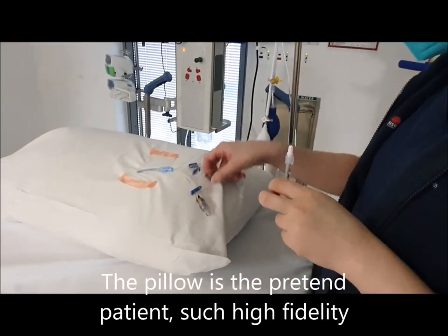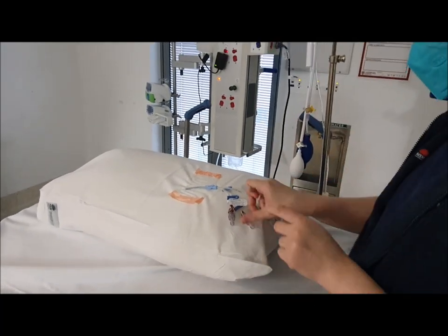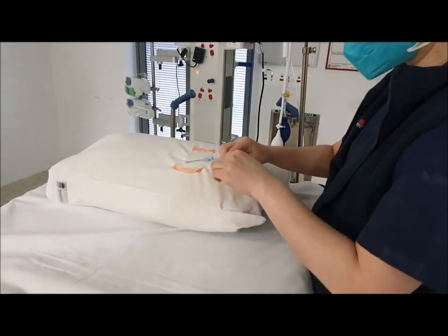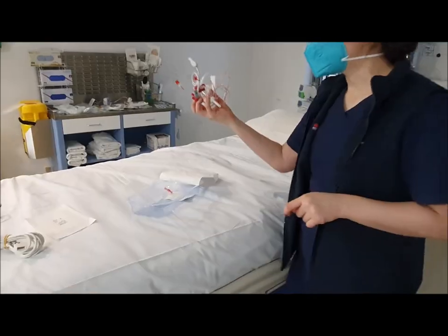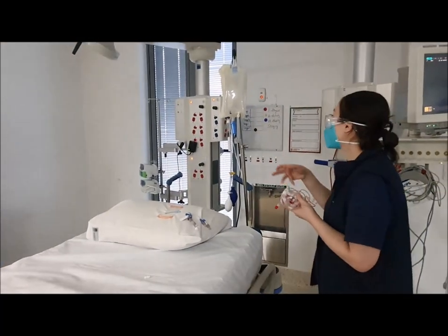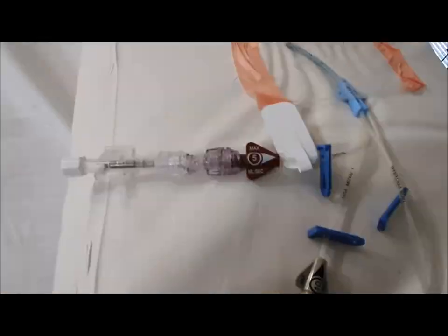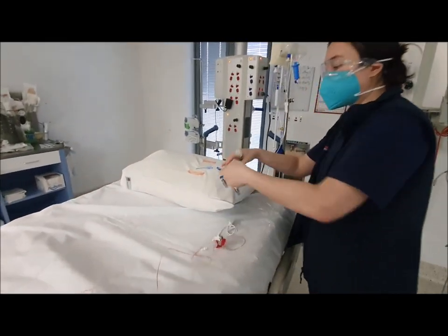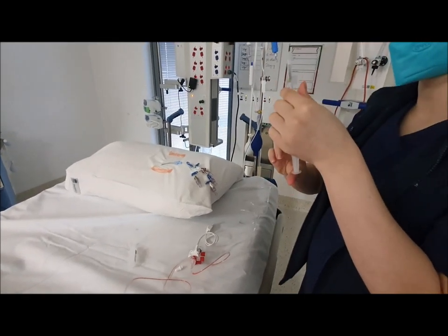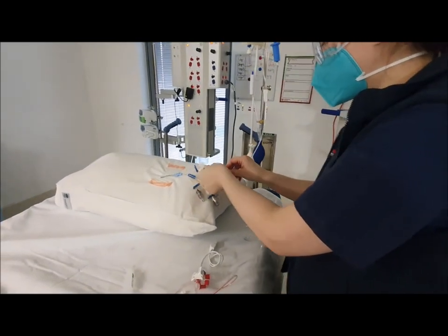I'm going to use the brown lumen and prime this with normal saline, then just screw it on and put the cap back on. I'm going to prime the line using one of the normal saline bags in the pressure bag. I'm going to prime the thermistor with normal saline. Okay, so that's primed, and I'm going to attach it to the brown lumen.